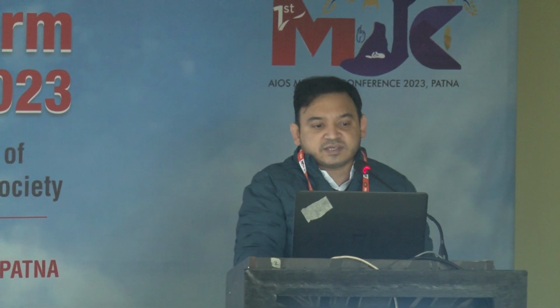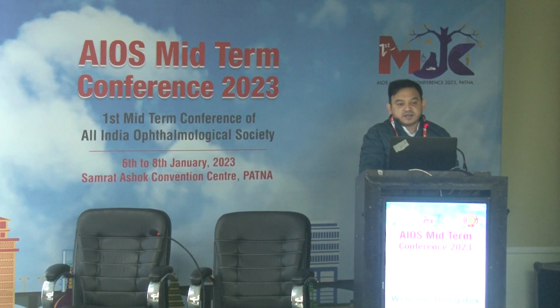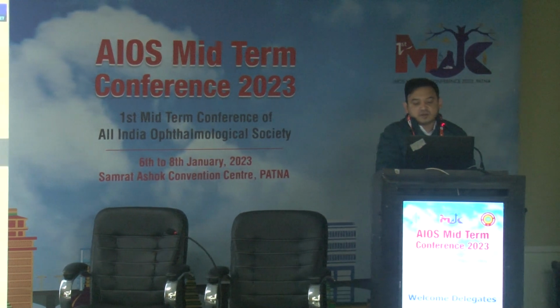My topic is choice of presbyopic IOL. As we all know, with increase in life expectancy and change in lifestyle, an increasing number of patients are now demanding independence for near and intermediate vision for their daily activities. There are a lot of treatment options available for the presbyopic IOL. But patient satisfaction depends on careful and individualized selection based on pre-existing conditions, visual need, realistic expectation, knowledge of the different optical designs, visual performance of the IOL, proper surgical technique, and eventual complication management.